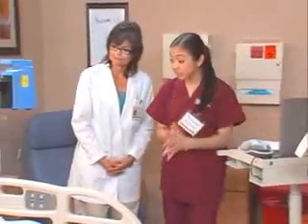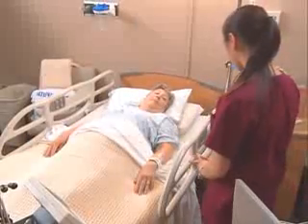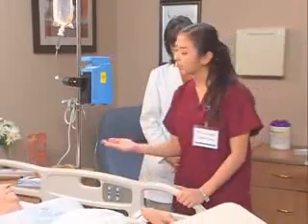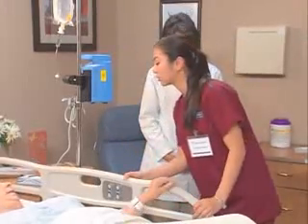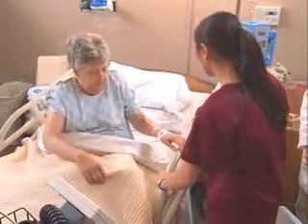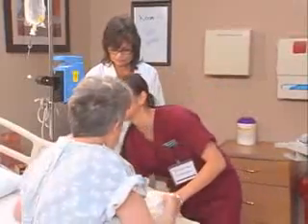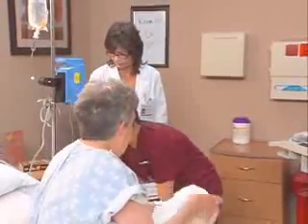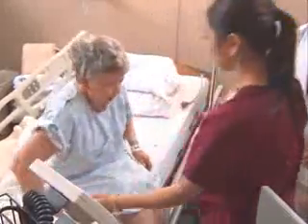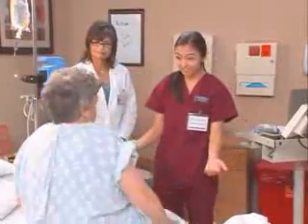Okay, now we're going to sit up and take your blood pressure and pulse again. As long as you promise to catch me. Okay, would you like your head up a little? Oh, please. Sure. Good. Oh, easy does it. Let's put this rail down. Great. All right, how do you feel? Not too bad. Okay, try to get comfortable now.